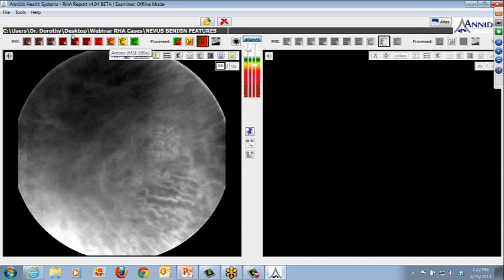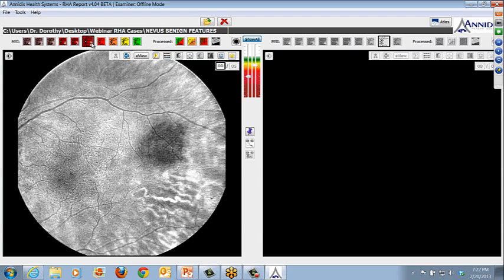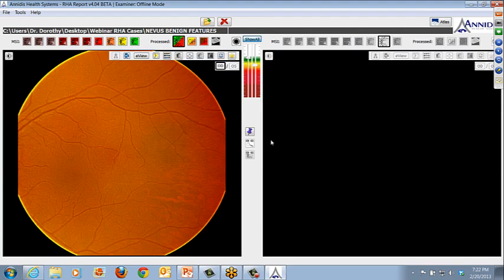So when you first look at these on MSI, they do look a little scary, actually. They all look like melanoma to me at first. But, you know, just keep those principles in mind. And again, if you have other modalities and you want to get a baseline, you can do some OCTs through this area. You can do depth analysis with OCT.